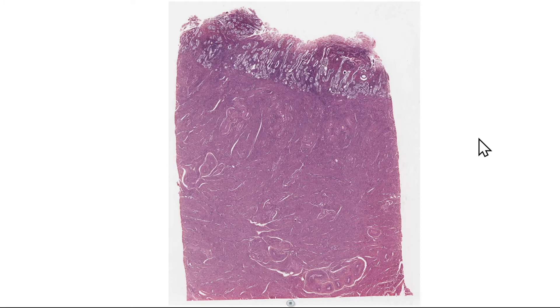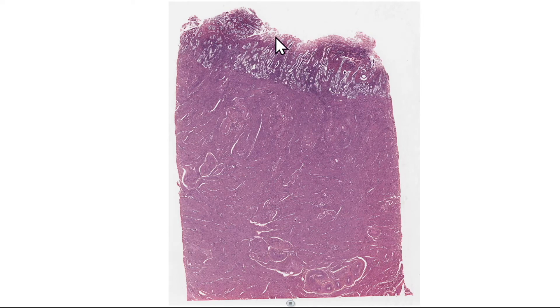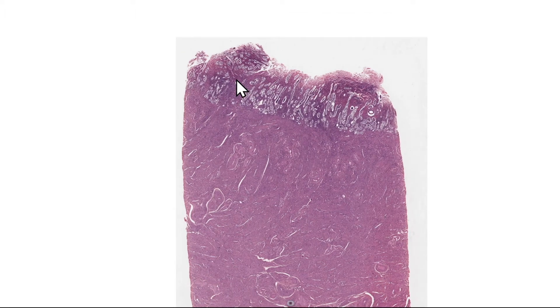That then causes ischemia to the surface tissue within the functional layer, and that tissue breaks down and eventually sheds and is released during menstruation. So what we're seeing here is the endometrium, and this is the myometrium — we're really focusing on the structure of the endometrium here.